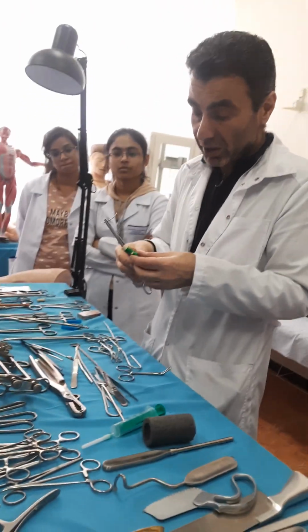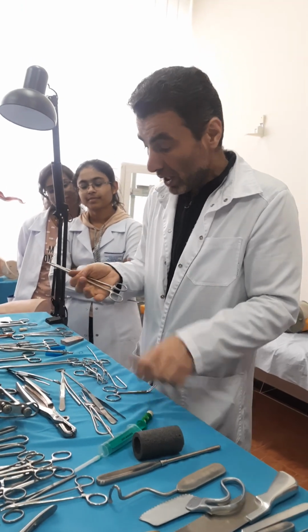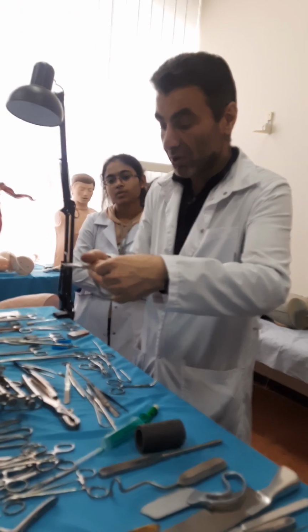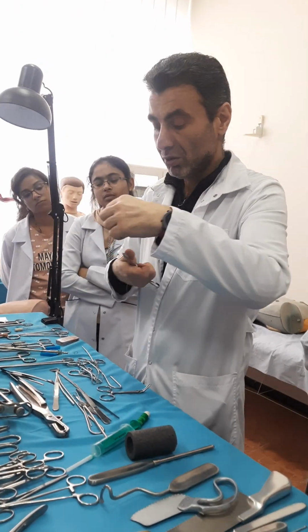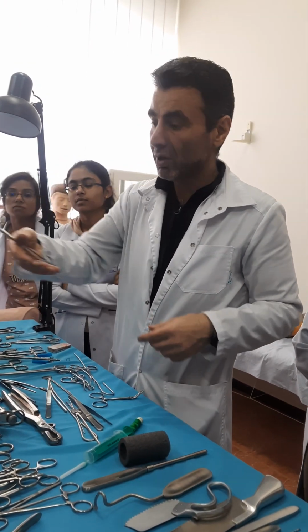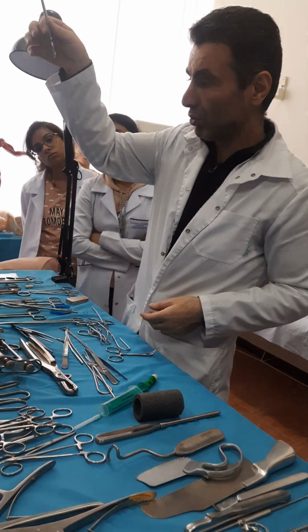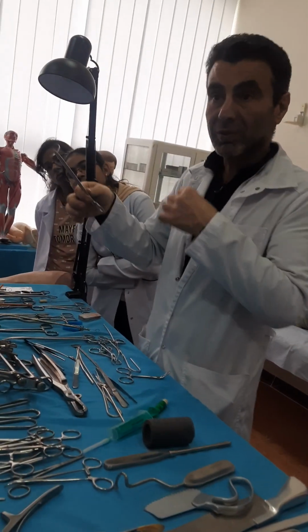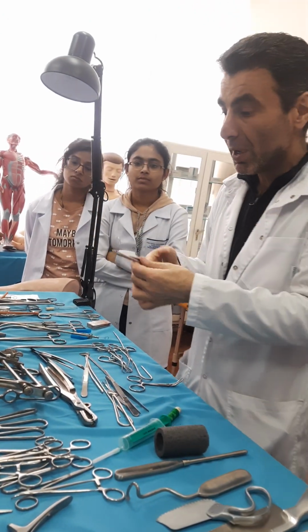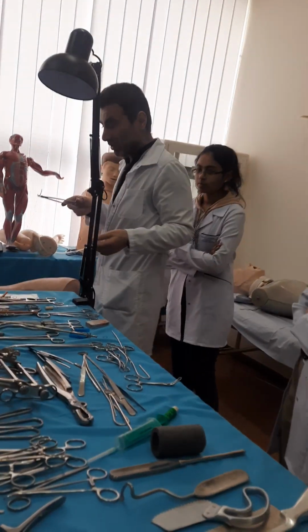In that position, I take the special thread, not this one, of course, and I insert it inside the eye. Yeah, you can see it has the eye. It is so simple. You fix it, you put it into the eye, and you insert it. After that, 1/3 is short, 2/3 is long, so as not to pull both threads through the aperture, or otherwise you will cause damage. So in that position, I start to make sutures. I will show afterwards, now I don't have time.